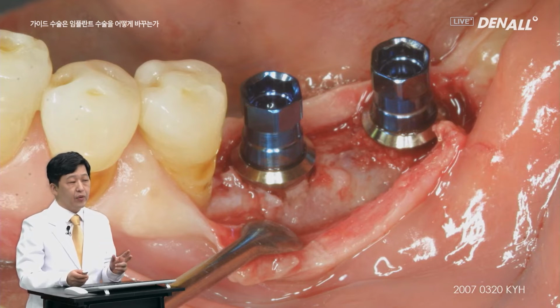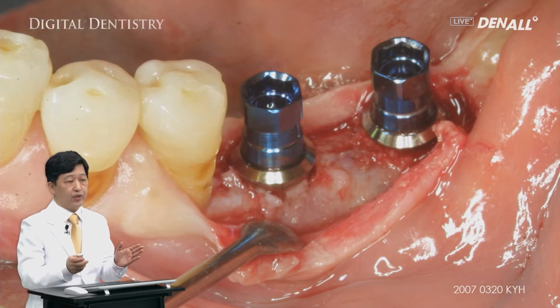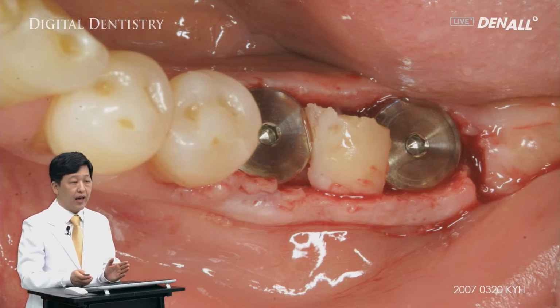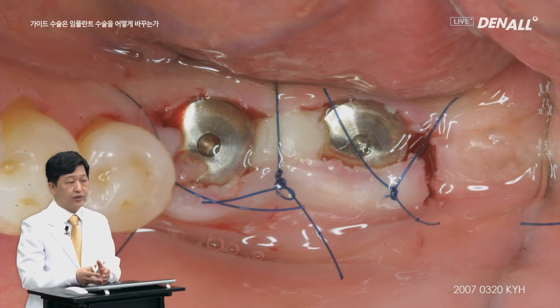SS3. In the case of SS implant with one stage concept, after you place the implant, there is a soft tissue gap in between implants. Therefore, you need to get soft tissue within the oral cavity and position it between implants in order to prevent a soft tissue gap from forming between implants. You can prevent surgical site opening despite suture using this method.